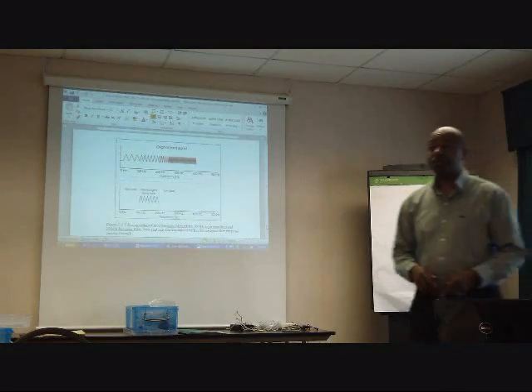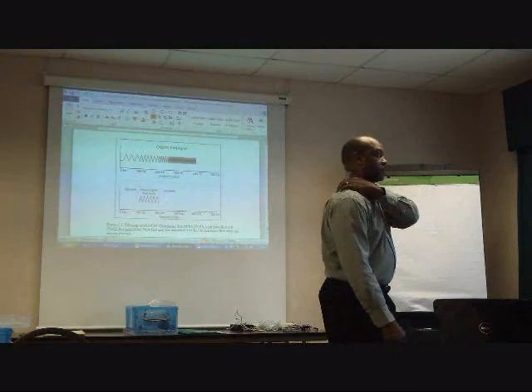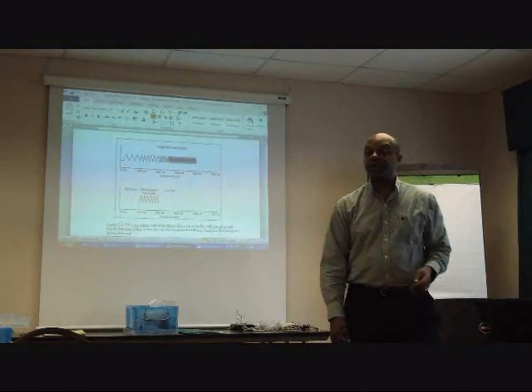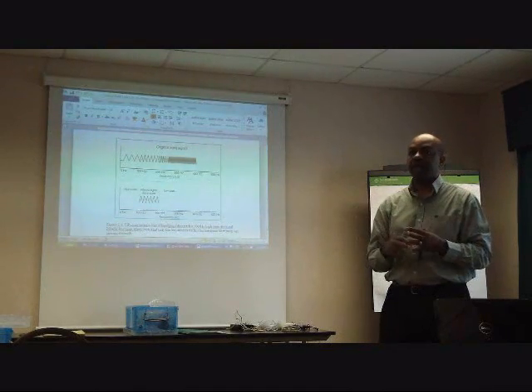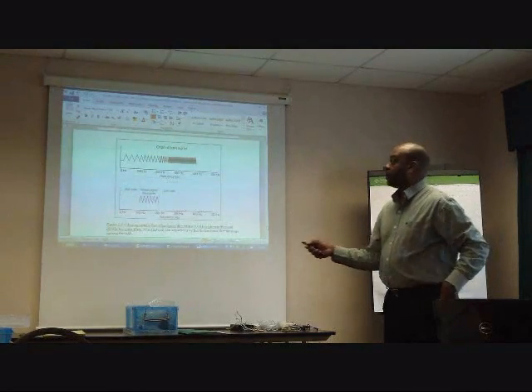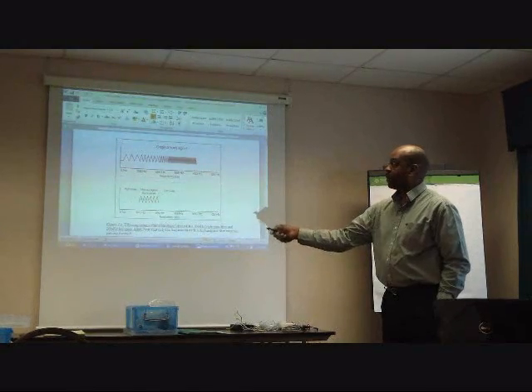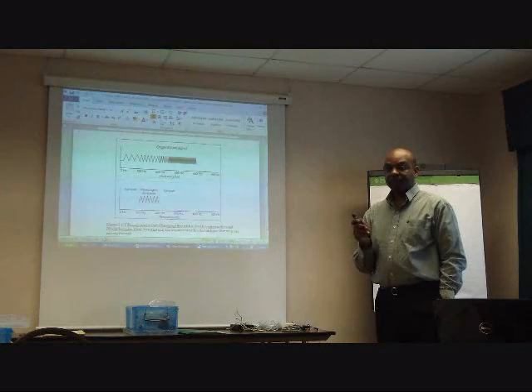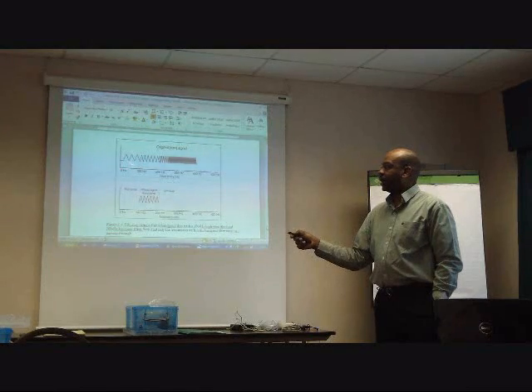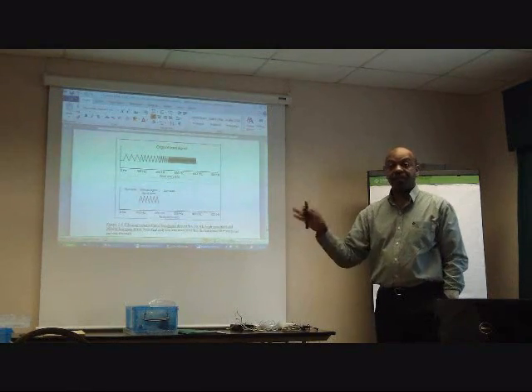I didn't understand that. Why would we switch? Well, one reason would be, let's say I want to measure muscle tension from the upper back. If I put sensors on the upper back and I use a wide filter, I'm going to be picking up from actually 20 to 500 hertz. So I'm picking up all of that. The problem is that the heartbeat is going to be within, I believe, 20 to about 90 hertz. And it's a very strong electrical signal.